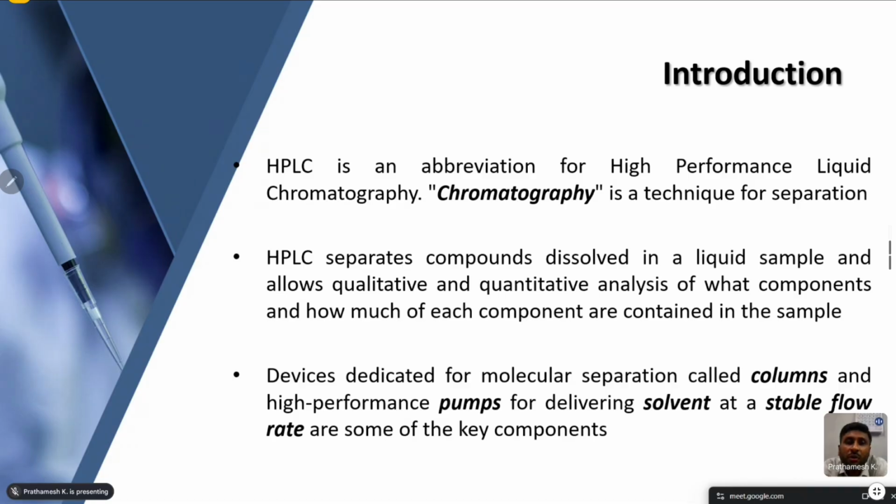If you have to define it, it separates compounds dissolved in a liquid sample and allows qualitative and quantitative analysis of what components and how much of each component are contained in a sample. So if you have a mixture containing three different components, chromatography will help you to separate out those three components, identify what each component is, and also quantify each component individually.